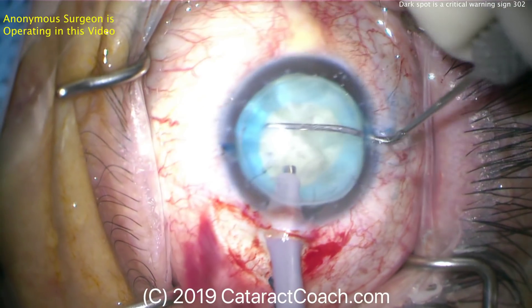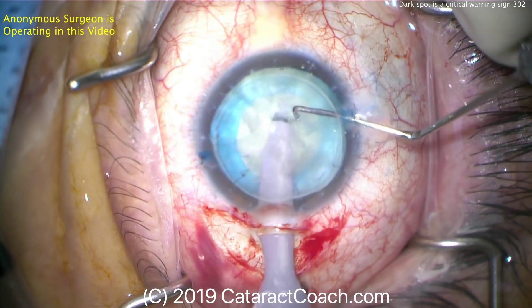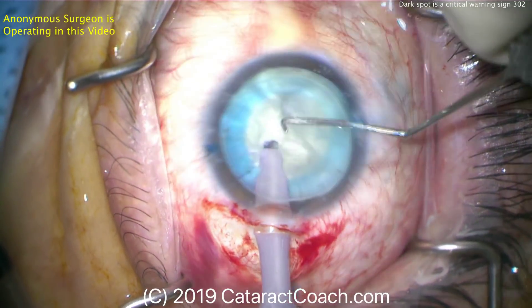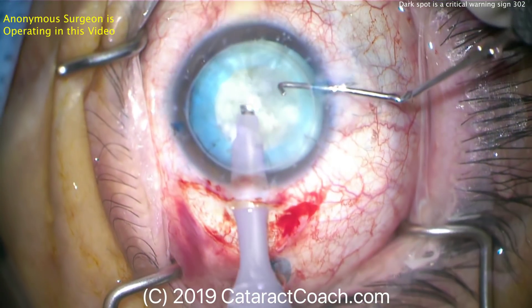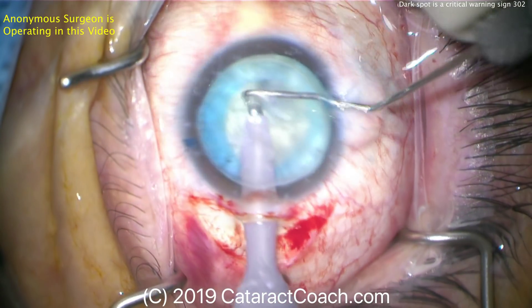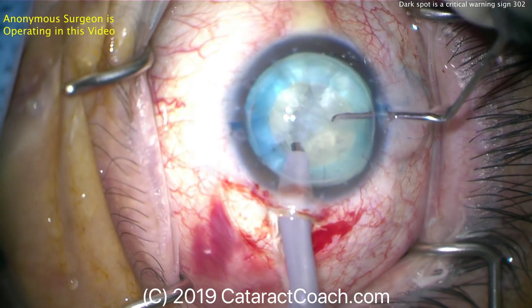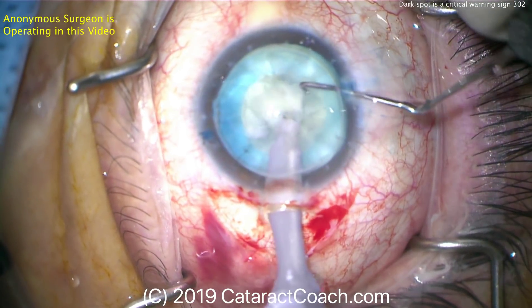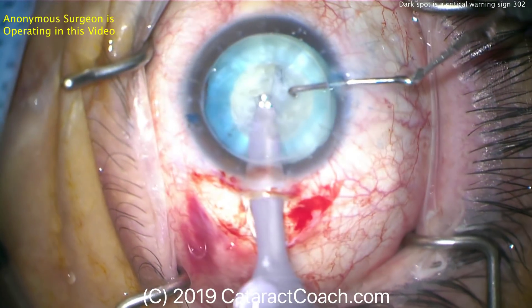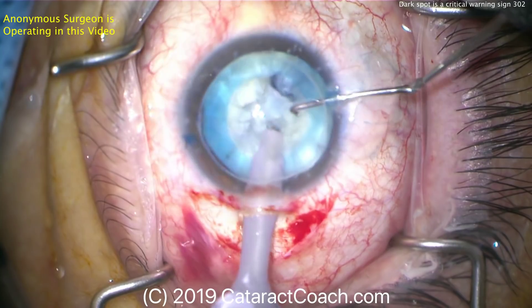This nucleus is going to be pretty soft, probably not a lot of dense material here. You're going to be very careful in aspirating this because this soft lens material will suck out very quickly and you can inadvertently hit the posterior capsule. Vacuuming here — not really much coming out, just some soft stuff. You can see the chopper goes right through it, so it's relatively soft material. A little more vacuum there, and then being very careful. Remember this lens is soft. And a vacuum there — and that's the warning sign.